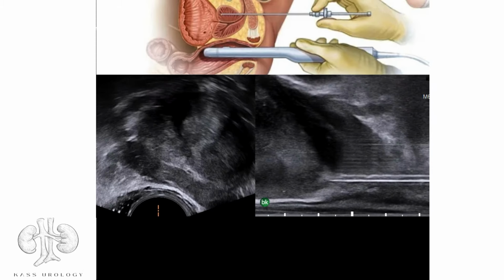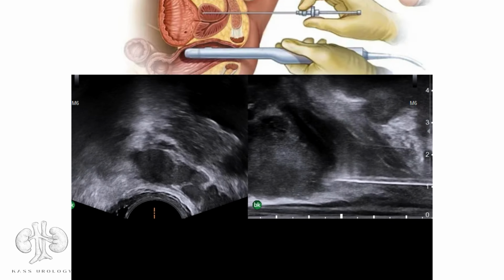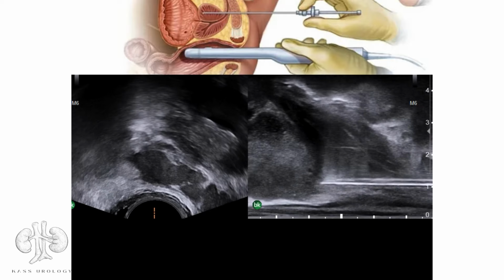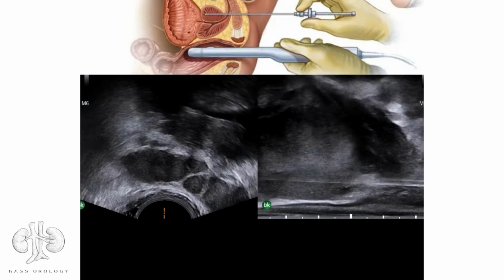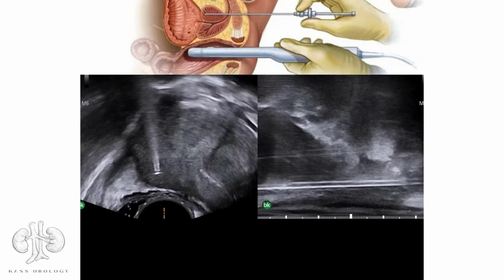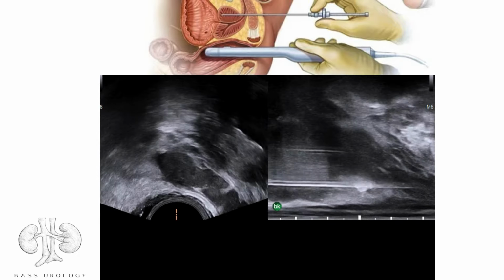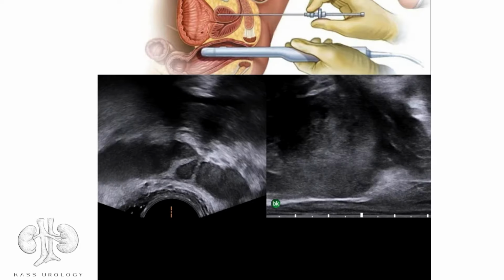The targeted lesion is clearly seen on the sagittal view in this video. And after positioning the access needle, the biopsy is fired, as you see, going exactly through the targeted lesion. This is also checked on the transverse view to ensure good targeting in terms of laterality. Another sample is obtained from the lesion of interest using the biopsy needle.